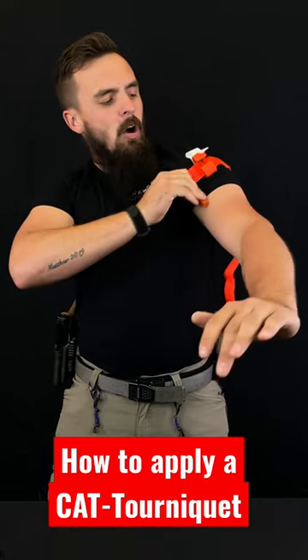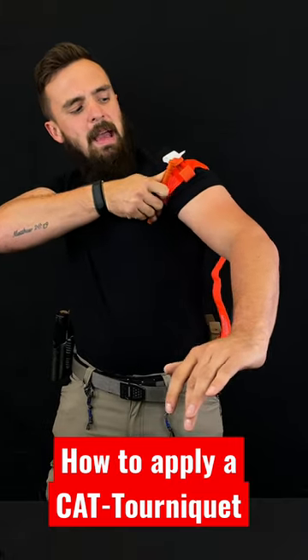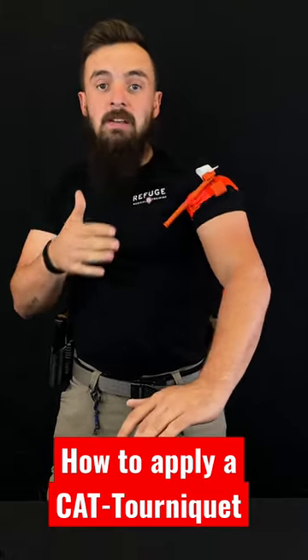Now remember folks, you always want it to be tighter than you think it should be, and you want it to go until the bleeding stops.